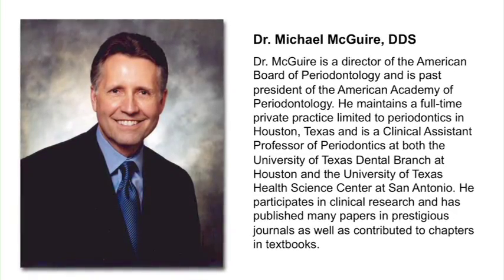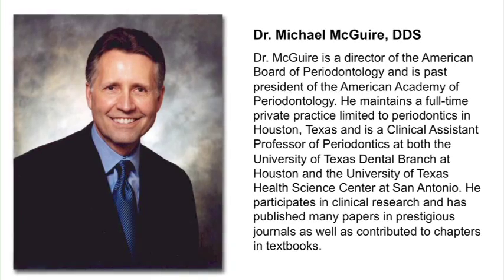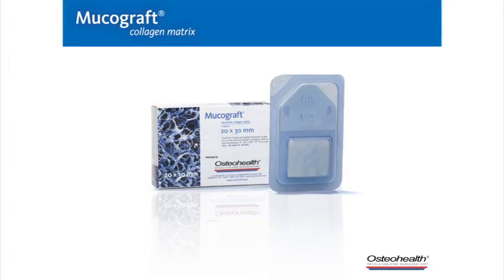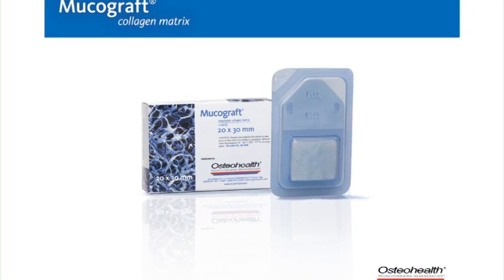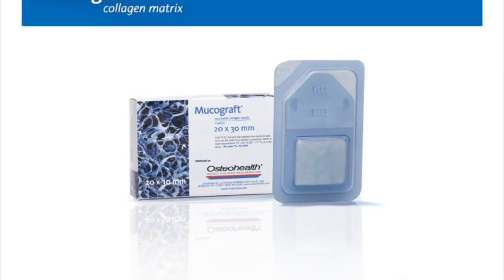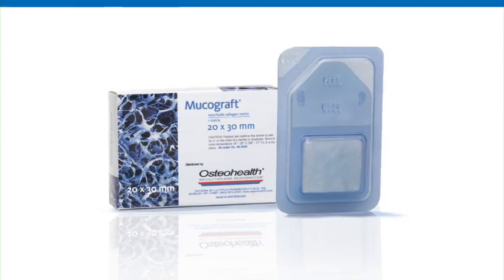Dr. McGuire's technique eliminates the need for a remote donor site, as is required with autologous tissue grafts. Mucograft is a three-dimensional collagen matrix which provides a ready-to-use alternative to autologous soft tissue grafts by acting as a scaffold for the regeneration of gingiva or mucosa.